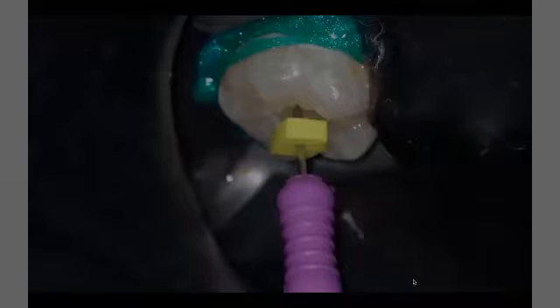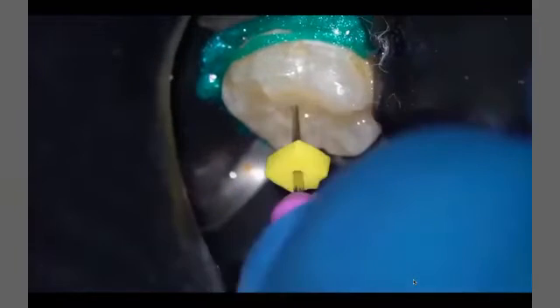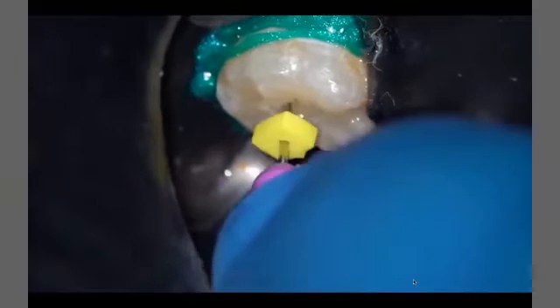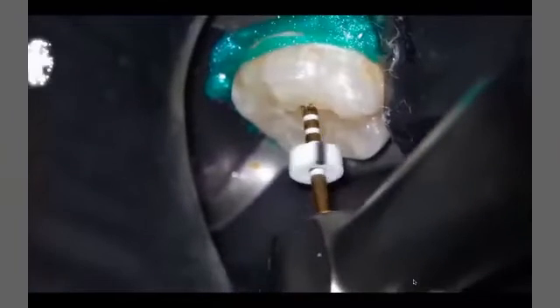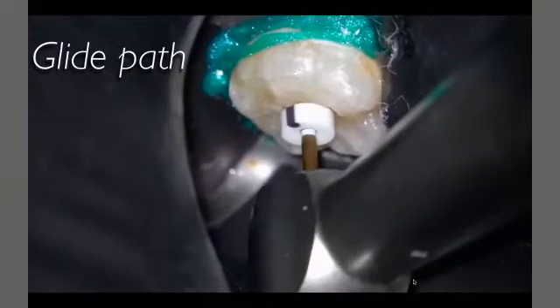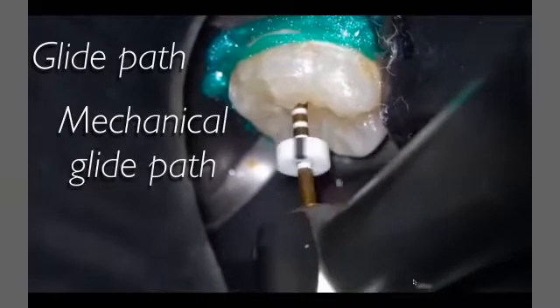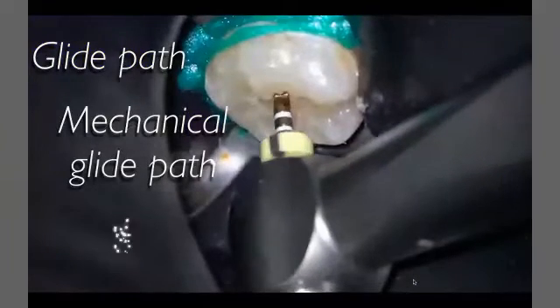After that, you can proceed with your normal root canal procedure and do the same for the mesial root canals also. Remove calcification with ultrasonic tips, glide path with the manual K files. When the 10 K file is loose at the working length, try to use the rotary glide path file to enlarge your glide path done with the manual files, and then go to the shaping.